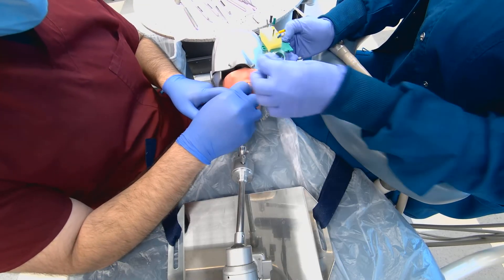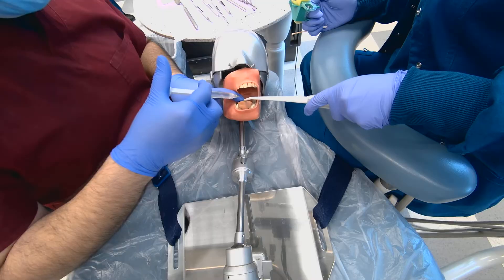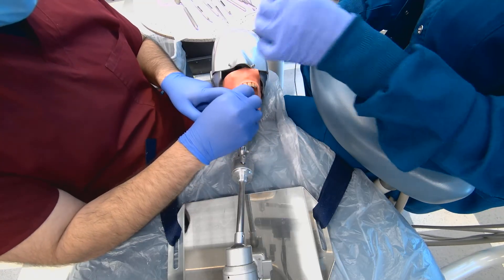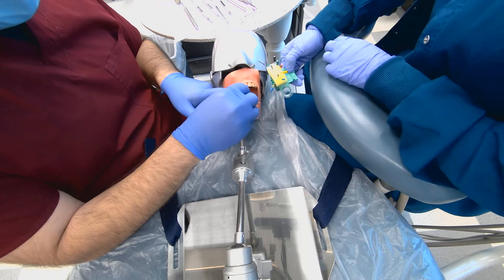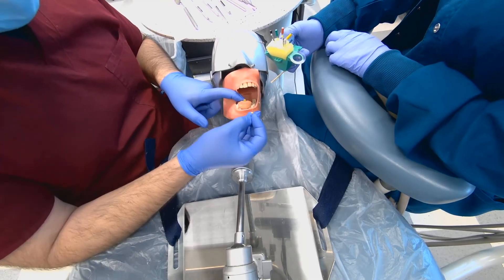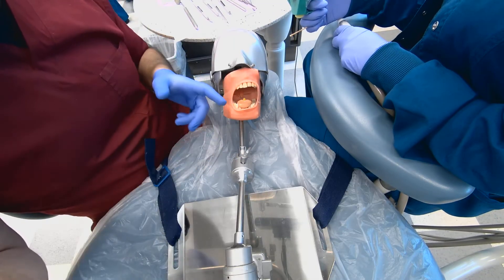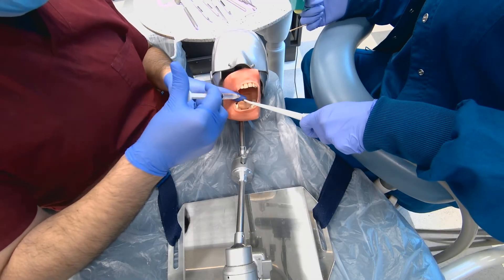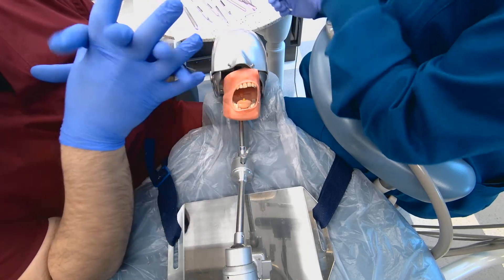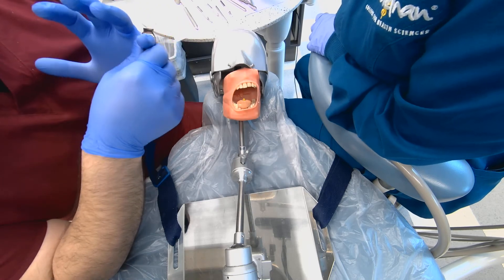Depending on the system, the newest systems have only three files, so we're just going to use three files and then irrigate. Sometimes the dentist would go back to file number 15 to recapitulate the canal, making sure it's open all the way to the end. We clean up the canal and check for clear, strong, brittle dentin — not soft dentin — which means we've reached the right point. We can then irrigate again, re-measure, dry the canal, or measure for the master cone.